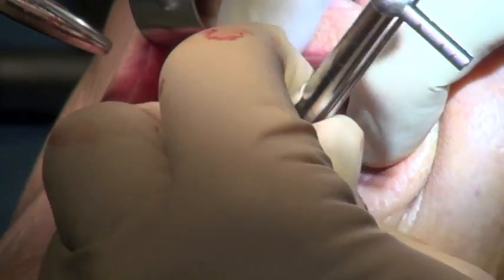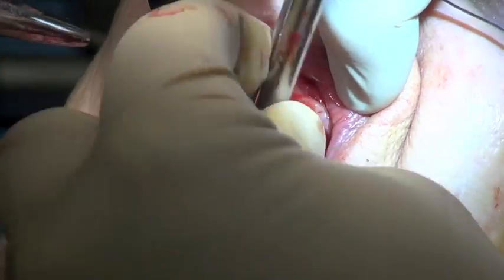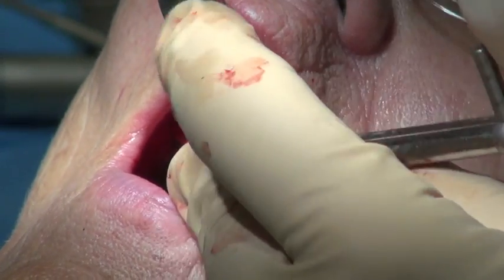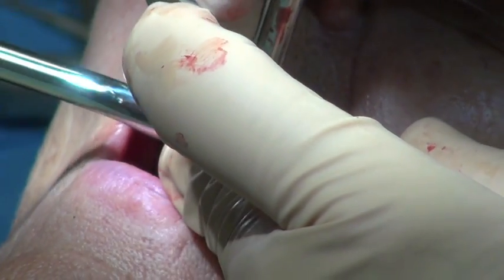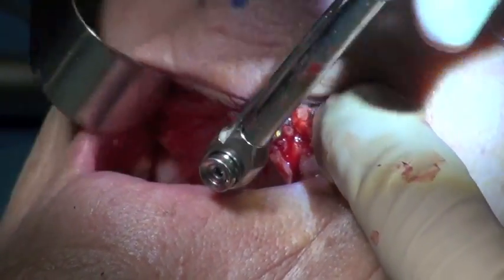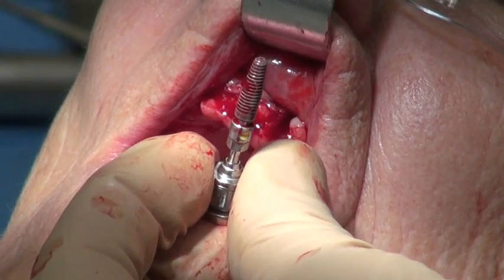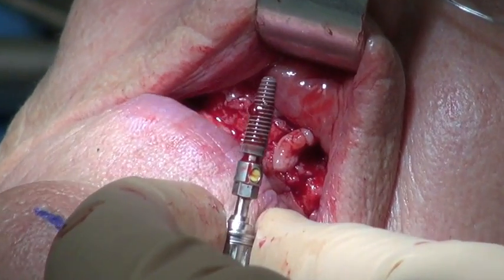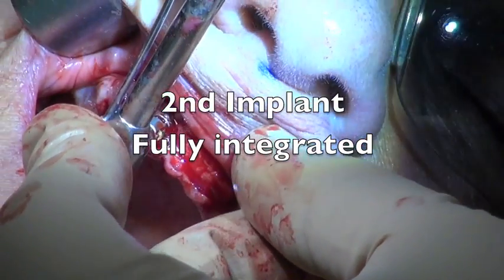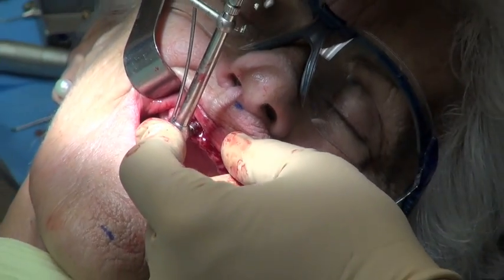We put the driver in where there's some bone loss and try to break the integration. You'll hear a click when the integration actually breaks. We engage the driver, put some pressure on it, keep it rotating in an axial direction — and there's the crack. That's the integration breaking. There's still a fair bit of integration occurring on this implant even with some bone loss. We take it out using the torque wrench — that was an easy one. The next implant is going to be tougher because it's a fully integrated implant, better positioned and still has a lot of bone around it.